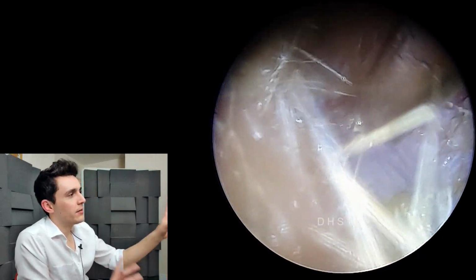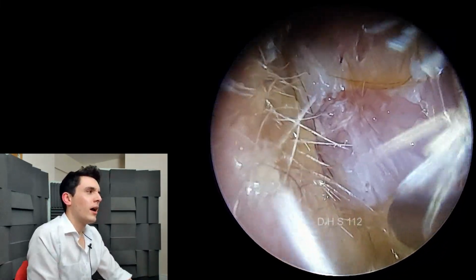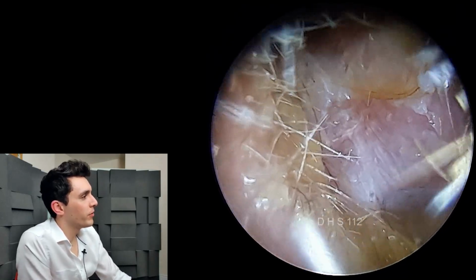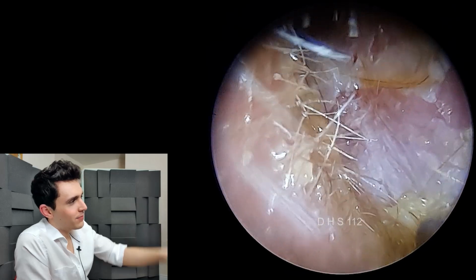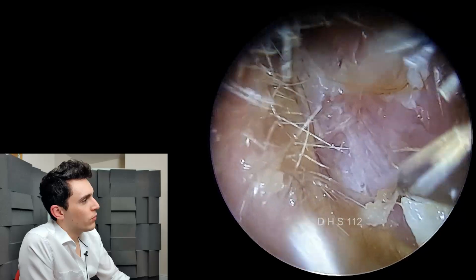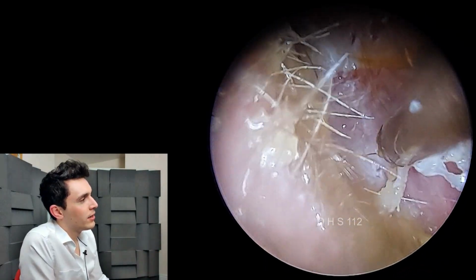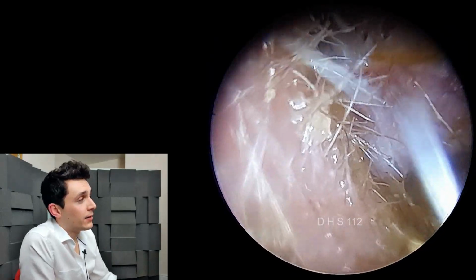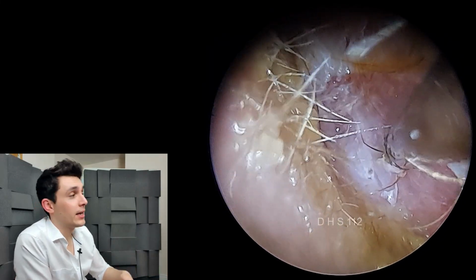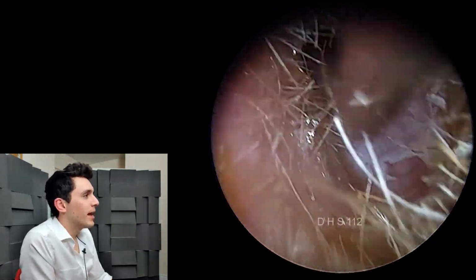And any kind of undue wetness that you see, that's just me applying sodium bicarb to the ear canal. For cleaning up dead skin like this, I find that sodium bicarb is a little bit more helpful than olive oil. And you can see here, I'm just teasing, to see if I can peel away any more. You have to be incredibly careful here, because if I create any break in the skin, then it's defeating the point, because you're just creating another entry point for bacteria to get in. So when you're doing peels like this, you have to be extremely careful.